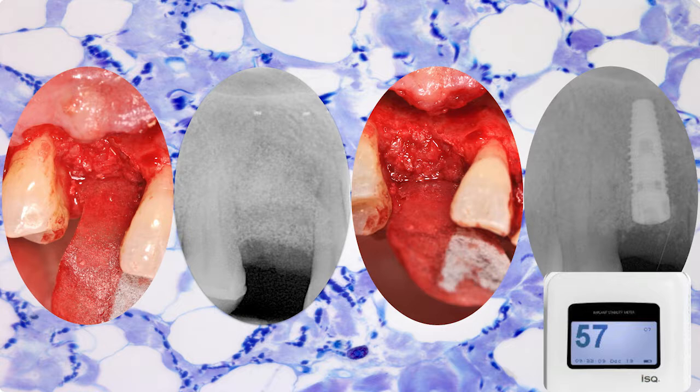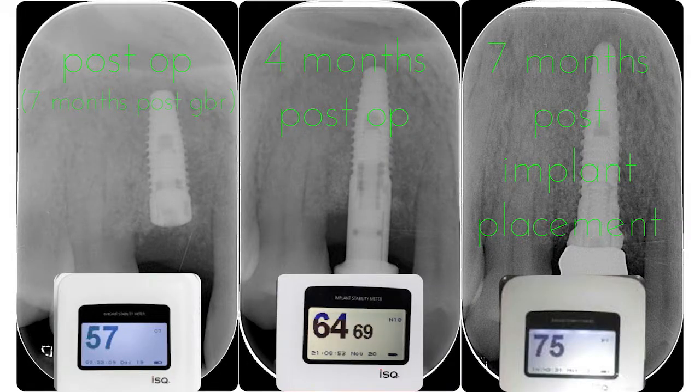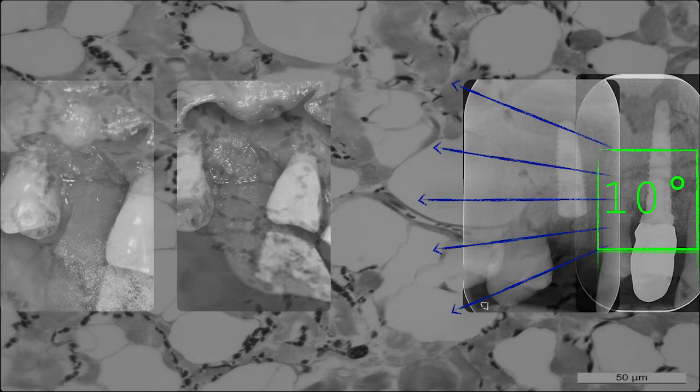Then after 7 months, I place the implants. ISQ value 57. Of course, I'm not feeling comfortable. But what is going to improve my confidence are the ISQ measurements. Because at day 0, when I place the implant, after 7 months from guided bone regeneration, I have 57. This tends to go up to 64/69, which is not sufficient to make me feel comfortable. And then I wait 3 months longer, and I got 75.